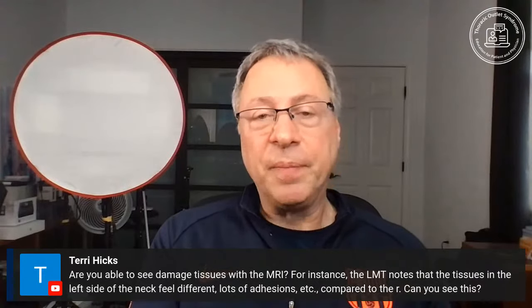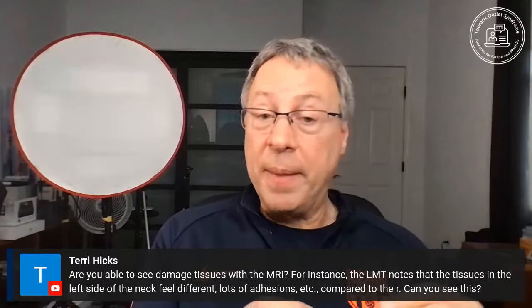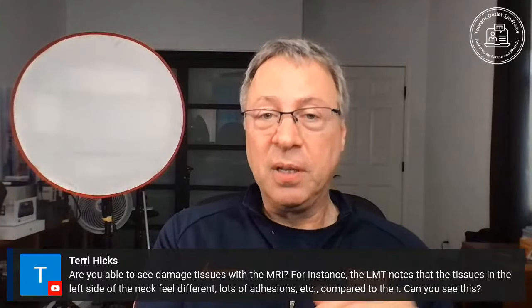But what we can see often is that the muscle is bigger in size, or maybe it's smaller in size. Sometimes with nerve damage, the muscles get very atrophic or small. The muscles can develop fat infiltrating into them rather than a normal healthy muscle. So it doesn't matter as much to us when we're looking at the path of the brachial plexus to know whether the muscle has changed on a microscopic level. What's important to us is how much space is the muscle occupying? Does it take space away from the brachial plexus or the blood vessels? That doesn't take away from the importance of knowing that the muscle may have changed.